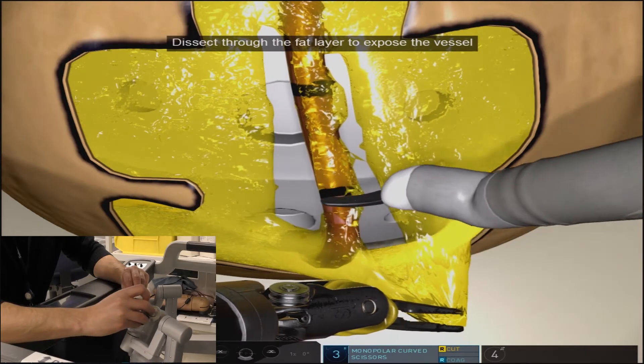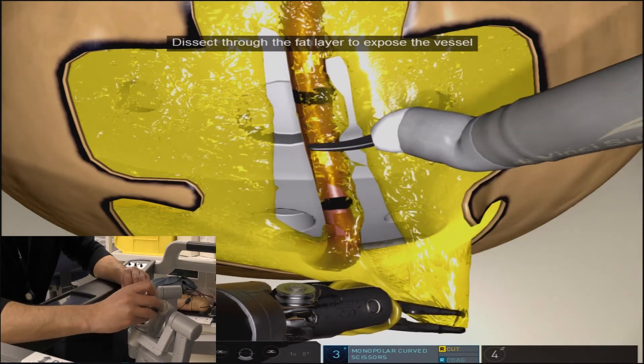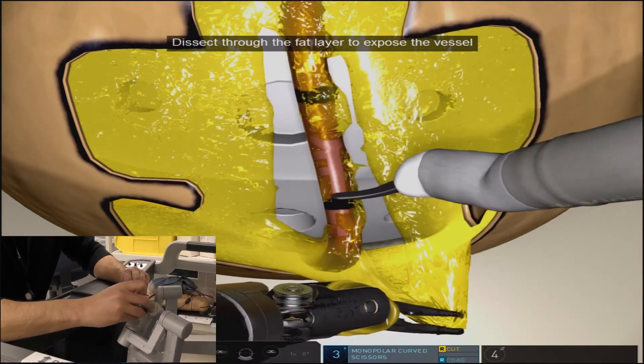You can see that at the top of the screen there is still a direction telling us to dissect through the fat layer to expose the vessel wall.